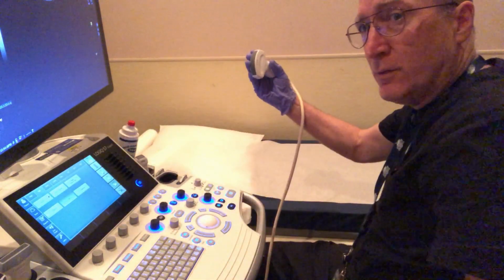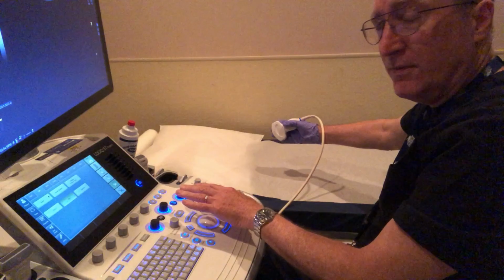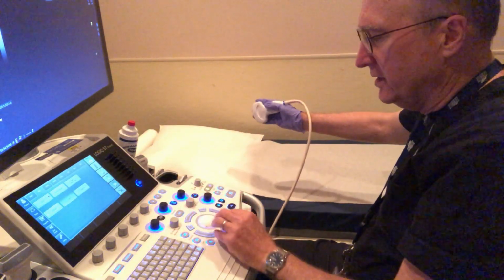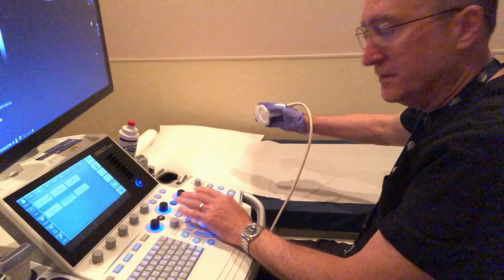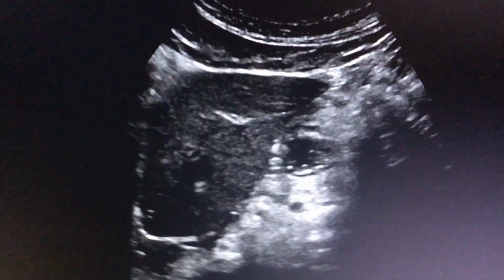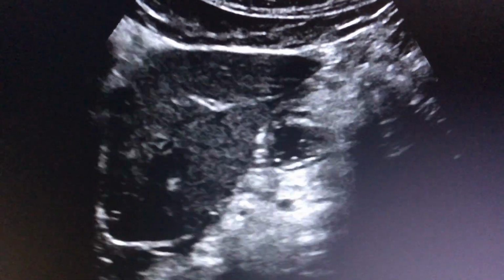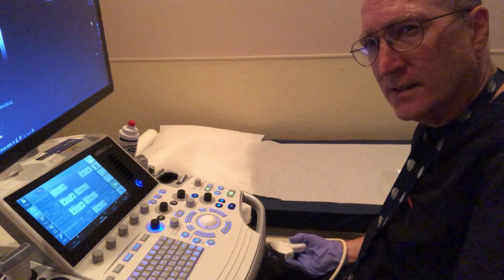Remember, you're scanning with your right hand. You're doing the controls with your left. If you're left-handed, you're just going to have to adjust. Scan with your right, controls with the left. Okay, we're finally scanning. Looks kind of dark though. Maybe we should turn up the gain.